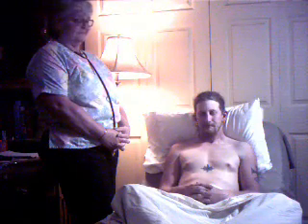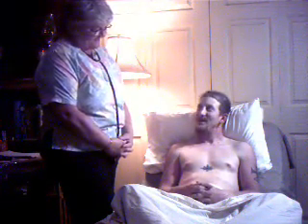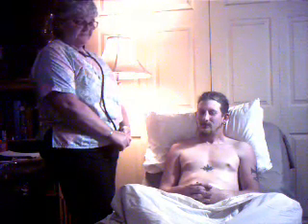Mr. Williams is our patient today. Hey, Mr. Williams, how you doing? I'm doing fine. How are you? I'm good. I'm going to be listening to your heart today with my stethoscope. Sounds great.